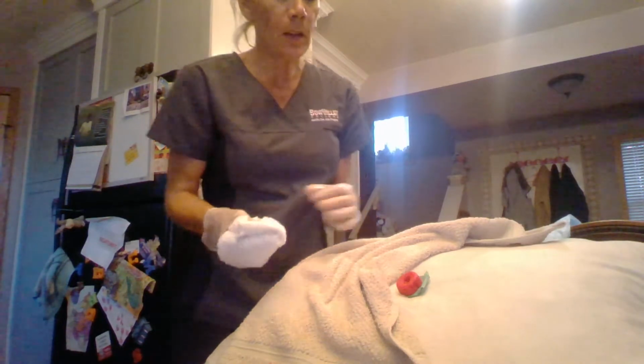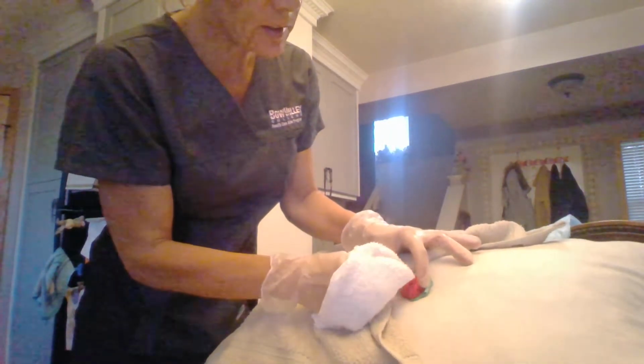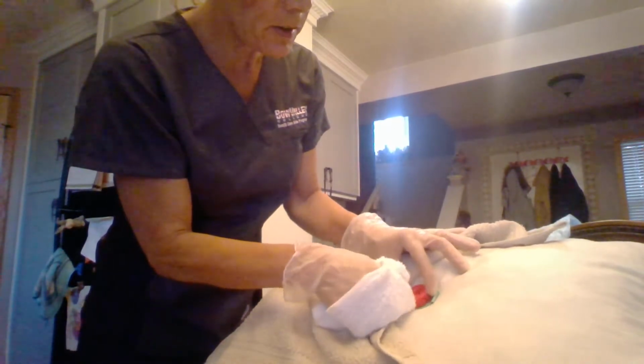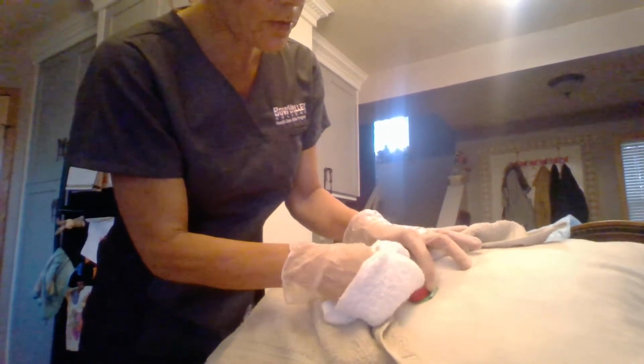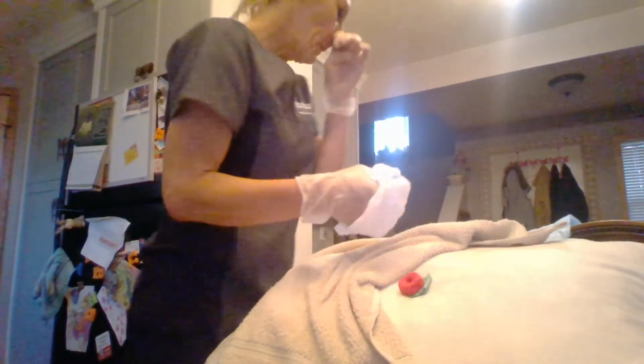So you can clean the area, wipe any excess off. Don't be afraid to pat it like this. It'll be moist and meaty and red or pink looking, healthy. The tissue does not have any feeling, really.